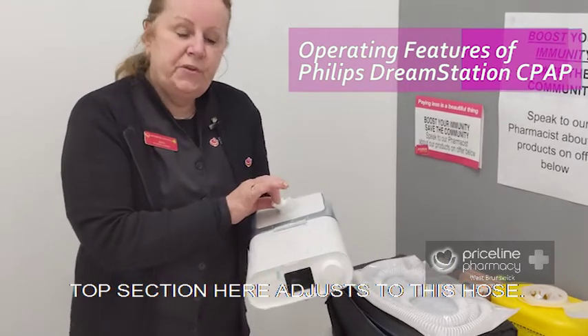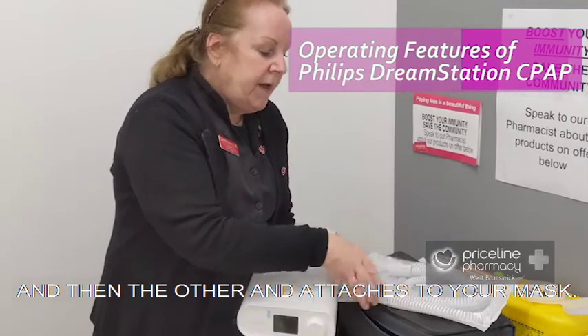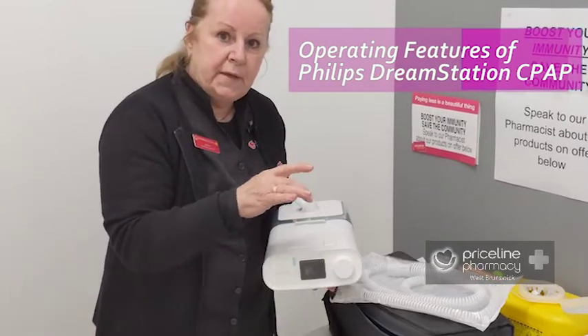The top section here adjusts to this hose. The hose clicks into the top of the machine and then the other end attaches to your mask.